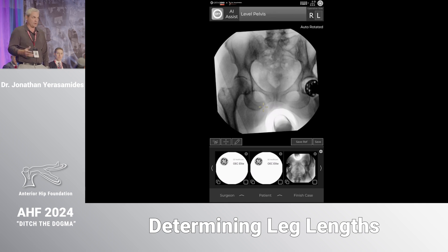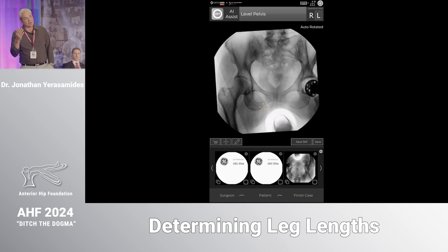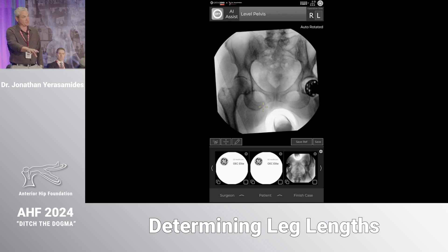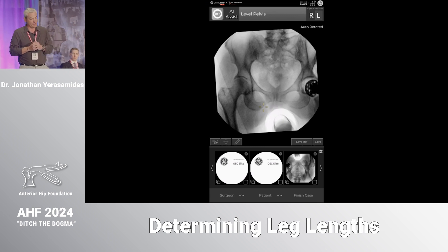We bring in the C-arm shot and we're looking at it. The landmarks I use — and John Masonis was talking a lot about consistent pelvic landmarks — are the ilioischial line and teardrop. A gross check is the midline of the sacrum to the pubic symphysis to see if I'm level, but the real key landmarks are those two. On my operative side the ilioischial line is lateral to the teardrop, and on the contralateral side it's touching the lateral side of the teardrop — so this pelvis is not level.